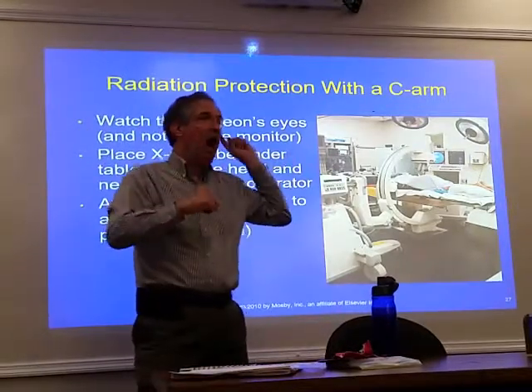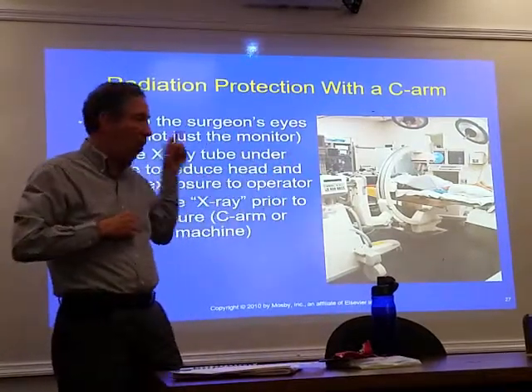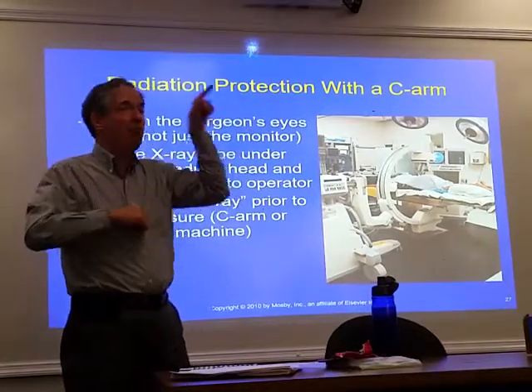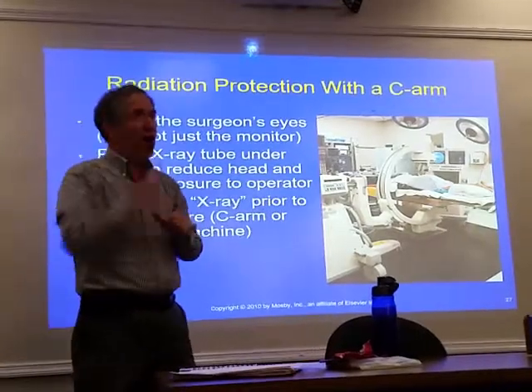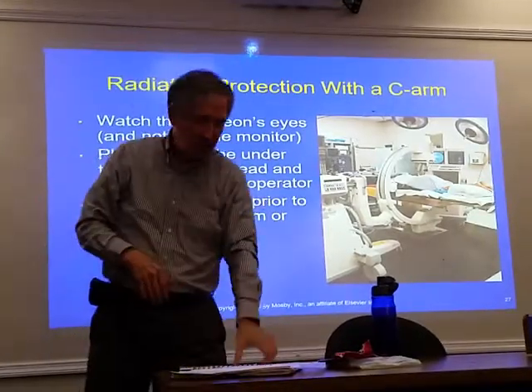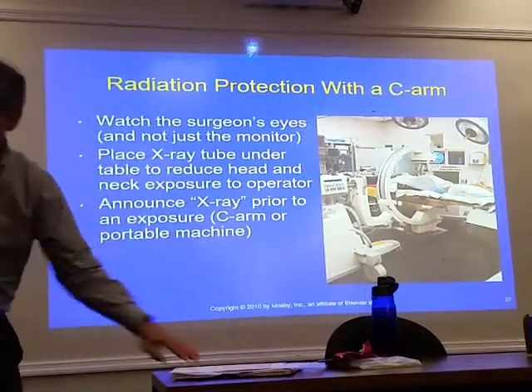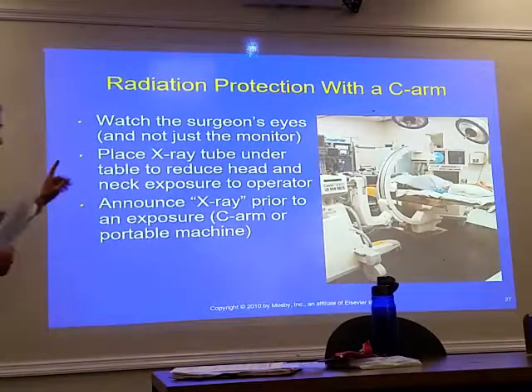So just keep in mind, one of the techs I work with would always watch the monitor. I said, you need to watch the surgeon's eyes. Because when they look away from the monitor, shut it off, because they don't need it at that point. If they look back at it and they want it on, they'll tell you that they want it on, okay? So that's something on here.